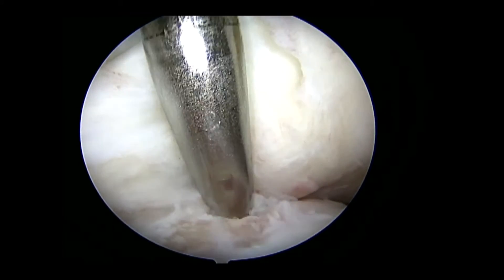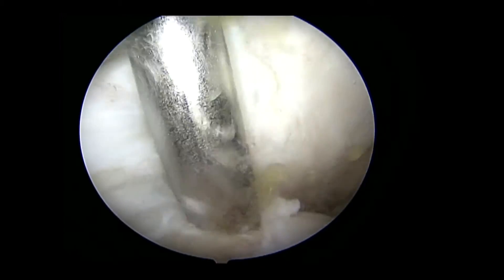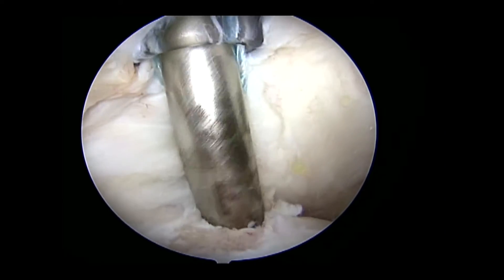The fiber wire limbs are loaded into a 4.75 mm swivel lock anchor which is inserted into the prepared reverse Hill-Sax lesion in standard fashion.